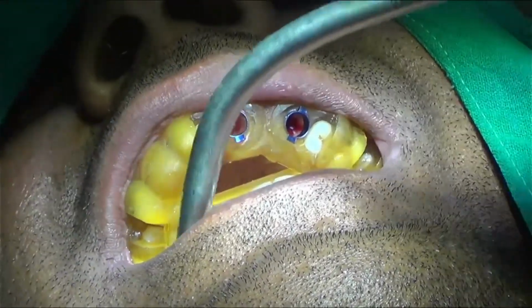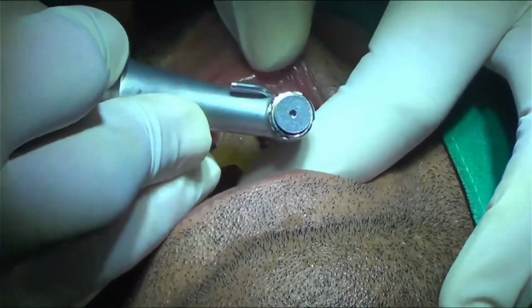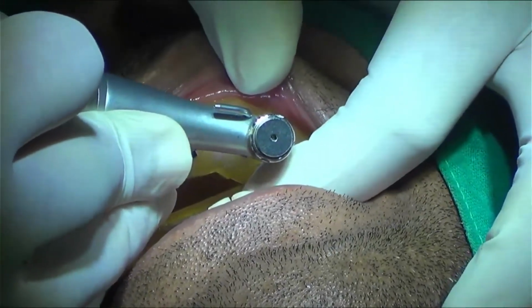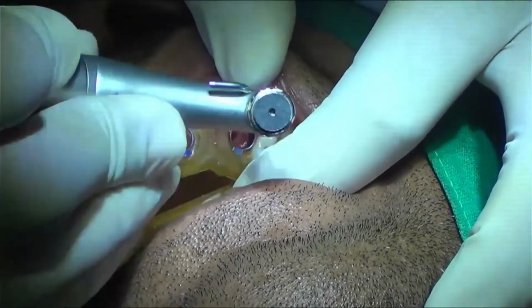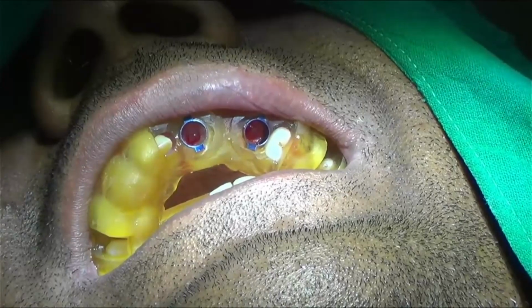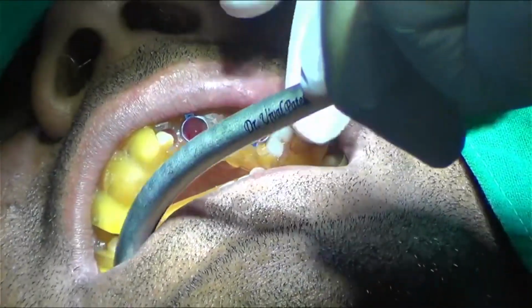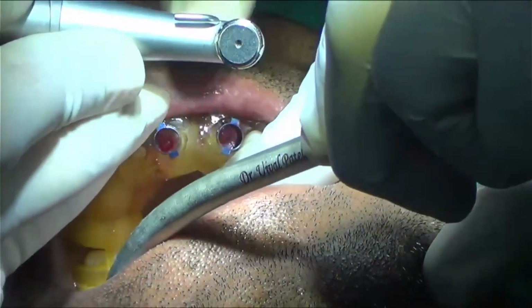As my 2, 1 and 3 are the same drilling protocol, I'm going to do the bone flattening in this one as well.